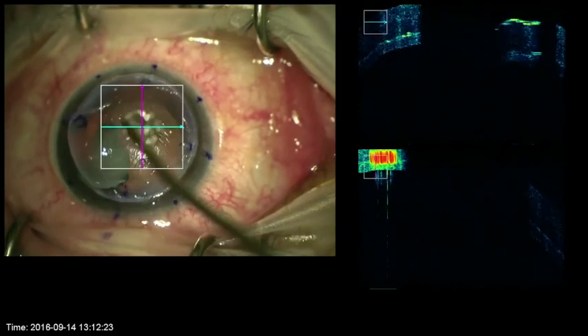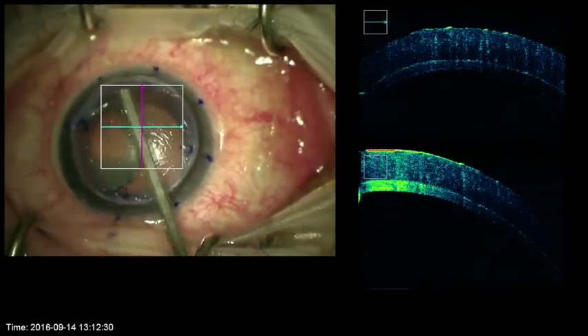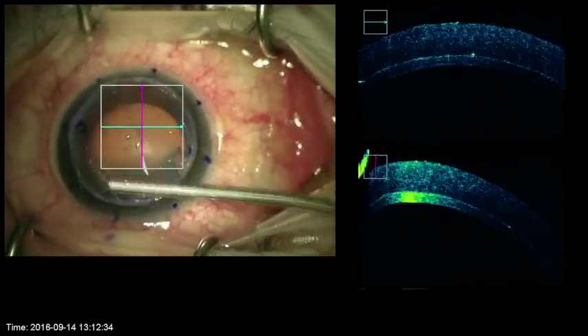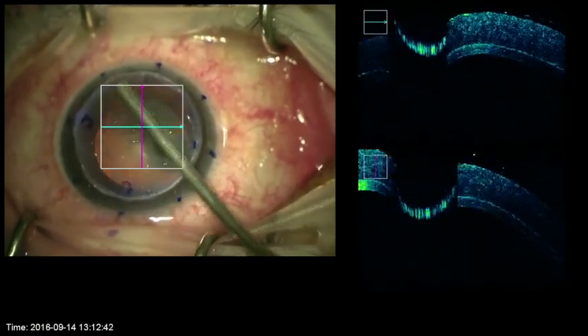One of the main benefits of the grip and rip technique is the smooth interface that develops in this natural tearing technique as compared to sharp dissection. Additionally, it avoids the perforation complications often seen with big bubble techniques and leads to excellent intrastromal clarity.